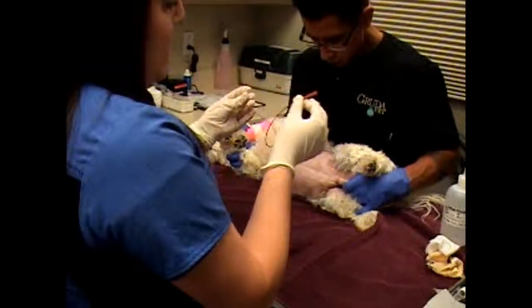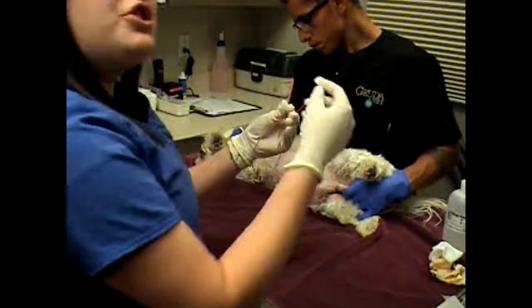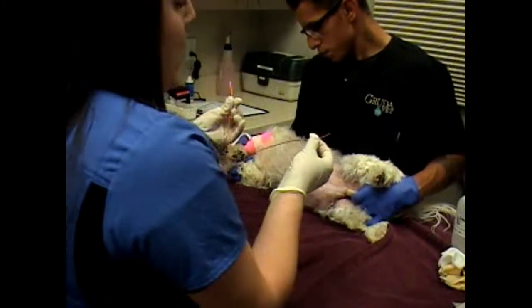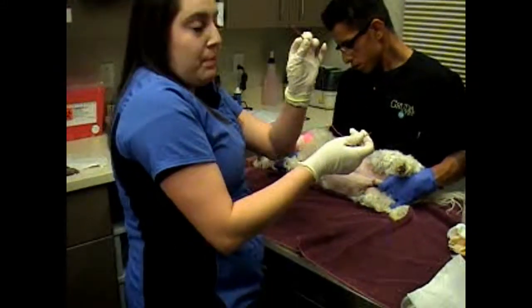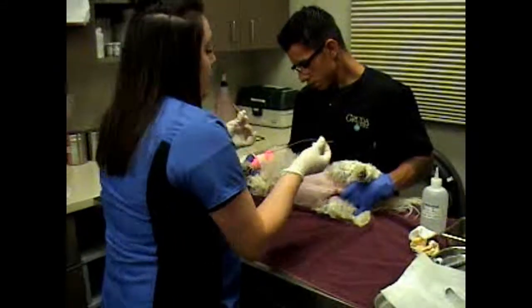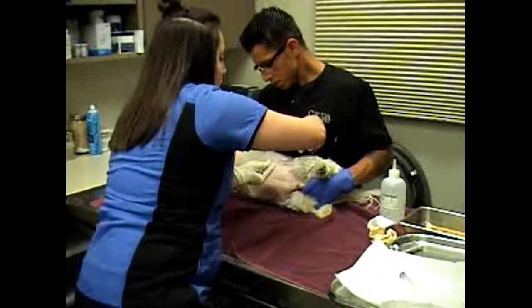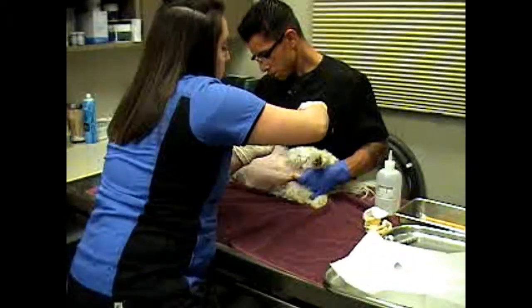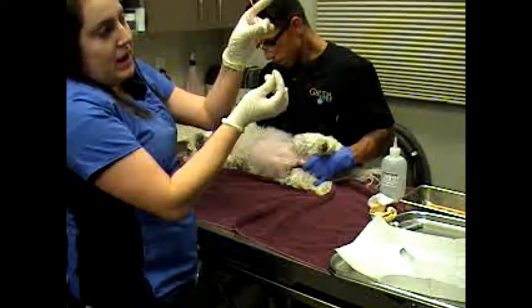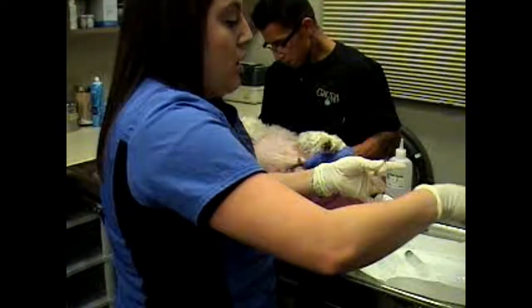So while Rachel is doing that, I'm going to just measure the length from the tip of the penis all the way to the bladder, just to kind of estimate how far I need to feed the catheter in. So obviously the tip and the eye of the catheter itself. So we'll just kind of estimate without touching the hair, without touching the patient itself. And I'm just going to use my fingers as kind of a little guide. So right about there is where I want to feed it to be in the bladder. Maybe a little bit more, a little bit less.